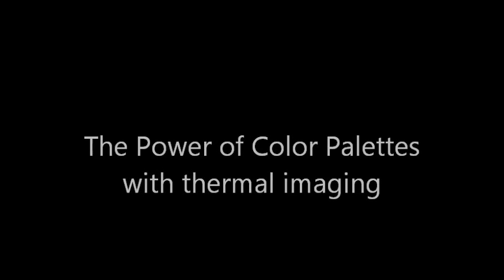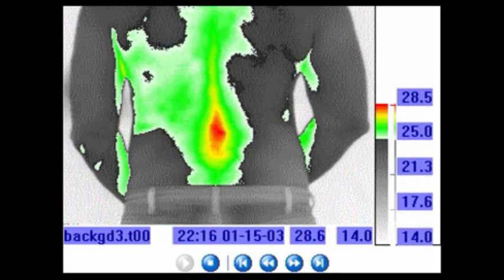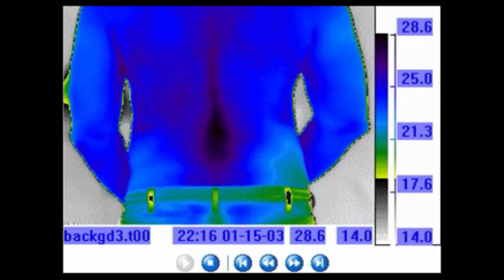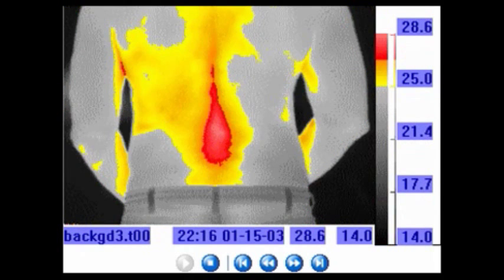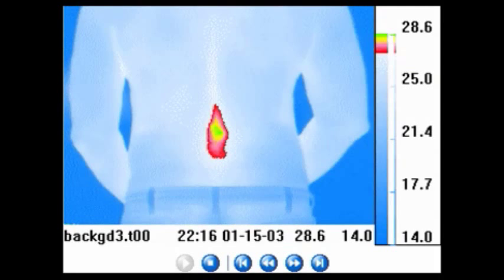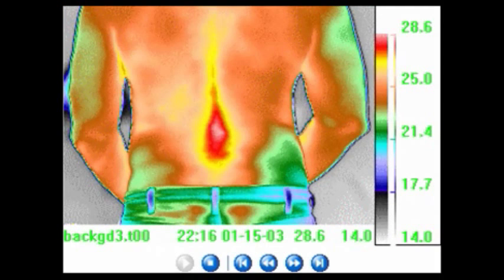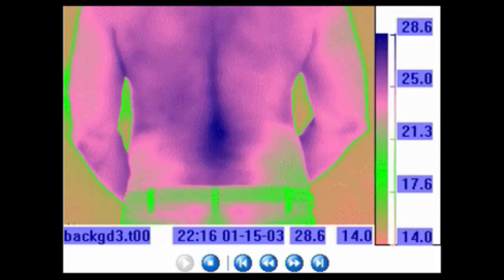This is an animated series to illustrate the effect on the same thermal image when different color palette combinations are used. The first example is a full spine view where 15 different palettes have been overlaid on this one image.